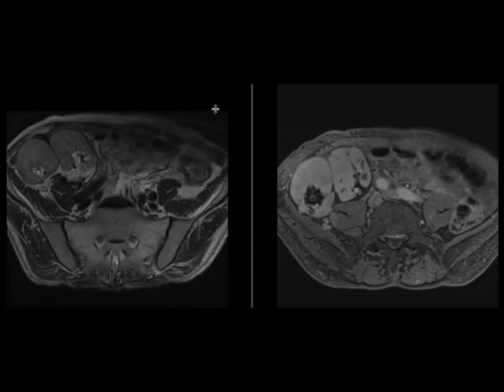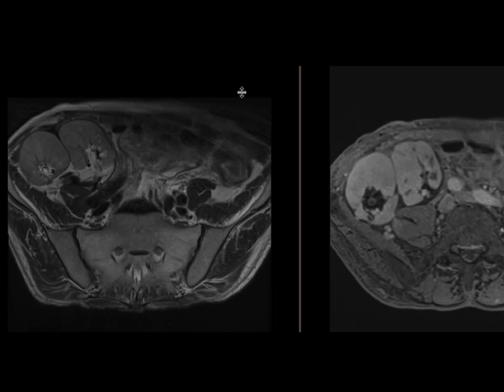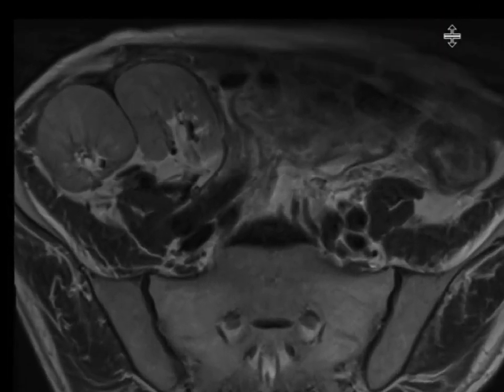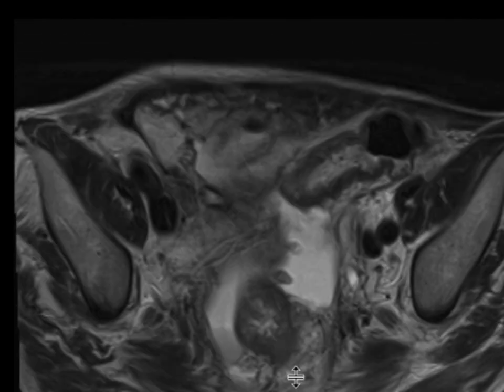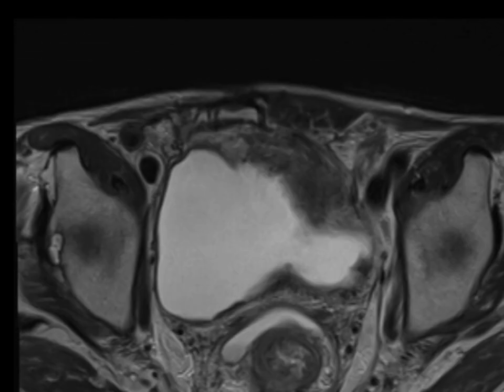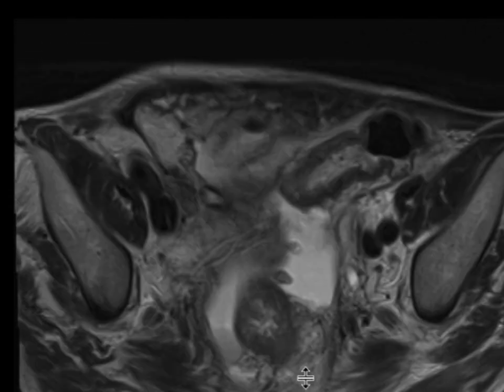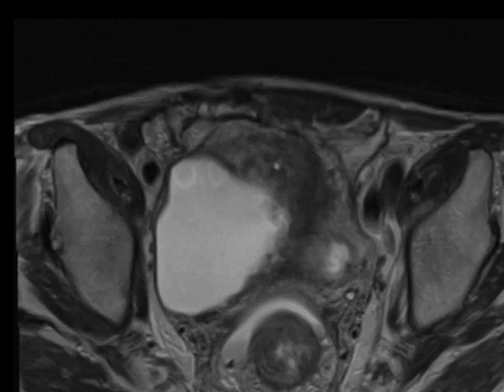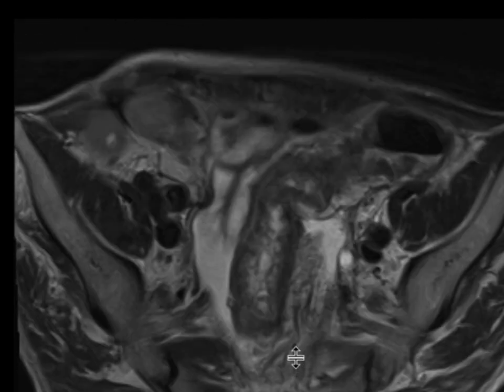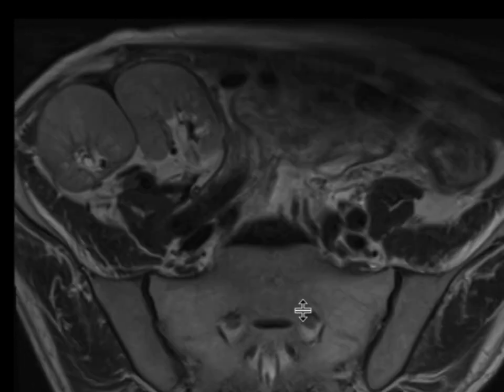This is a patient with a renal transplant who had some bowel abnormalities on a CT scan, and an MRI was requested to further evaluate this. We can see that the rectum is thickened, the sigmoid colon is thickened, and there's a whole bunch of other stuff going on, but I want you to focus on the renal transplant itself.